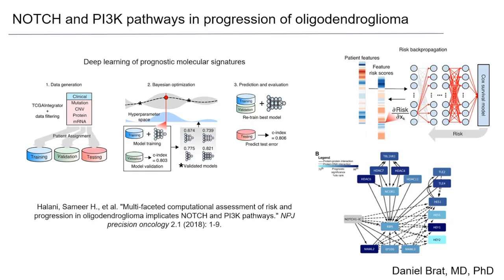Anything that we can do with images, we can also do with genomics. A lot of these survival modeling techniques, we first evaluate them using gene expression data. And so we can take gene expression profiles and try to learn from these to predict outcomes and do things like identify pathways that are enriched with important gene expression variables.